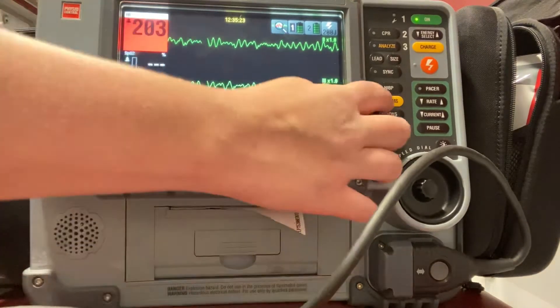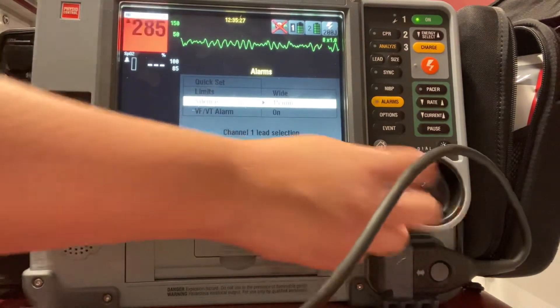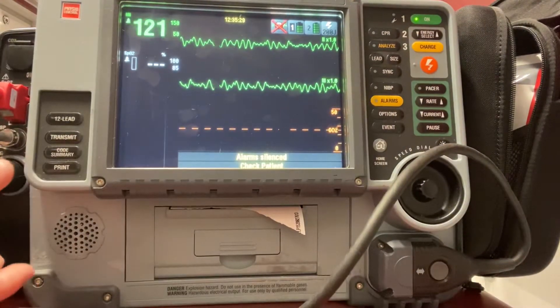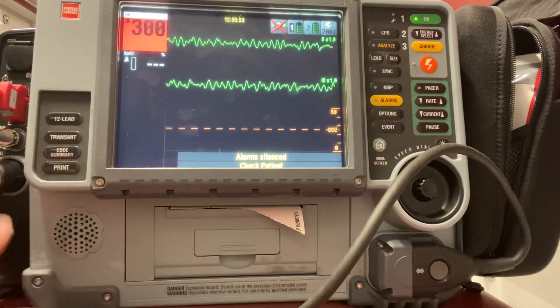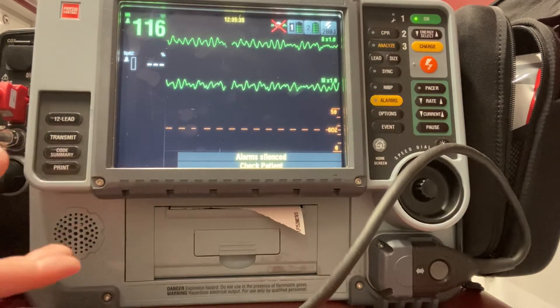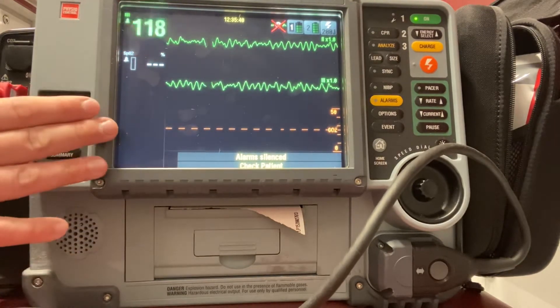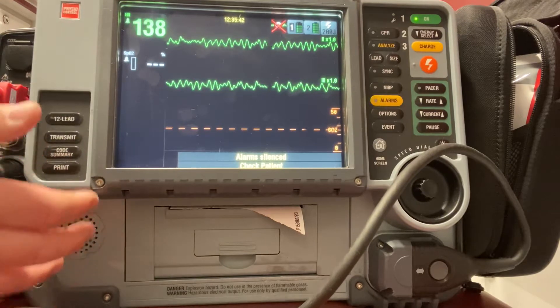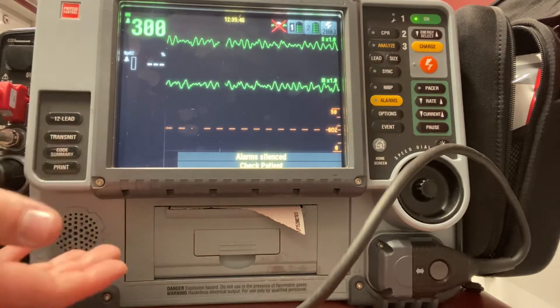In this video segment, we're going to go over how to defib a patient who is in a shockable rhythm. I get on scene, I have a full arrest — a patient who's in either VTAC or VFib but pulseless — so we're doing CPR on them. As soon as I get the pads on the patient and I recognize that it's a shockable rhythm, I should go ahead and defibrillate that patient.